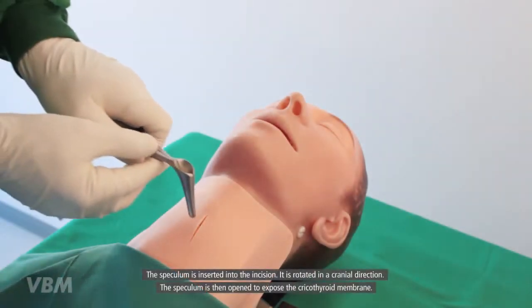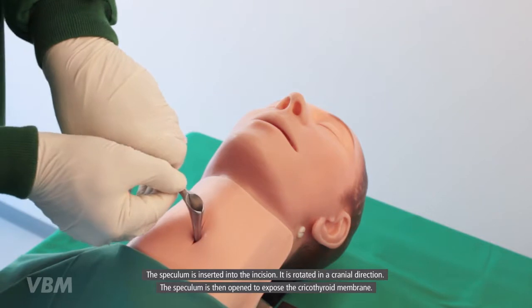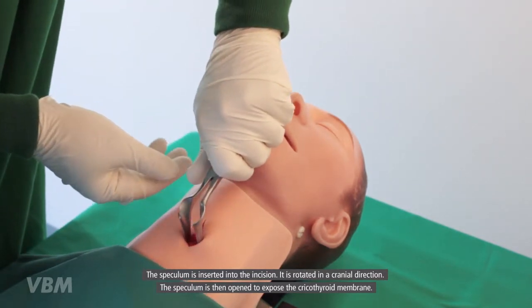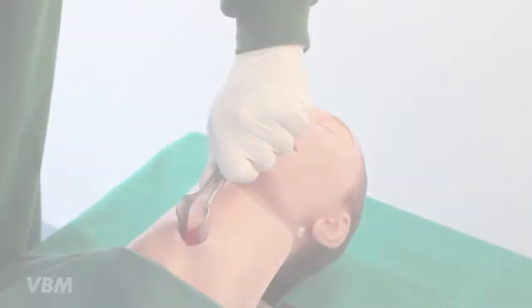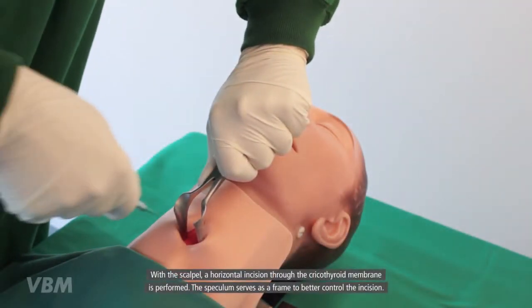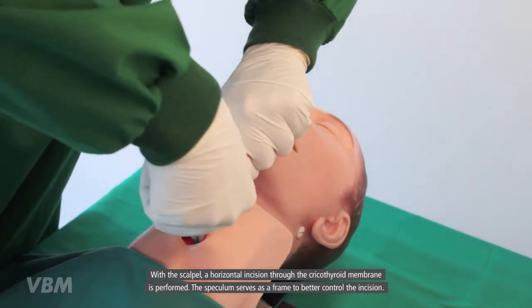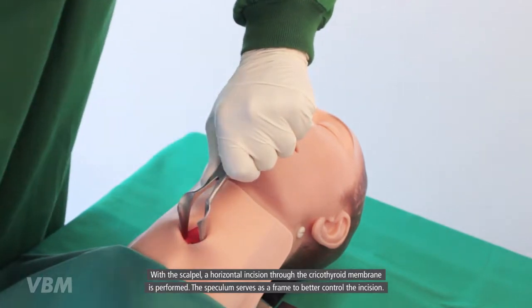The cricothyroid membrane is exposed using the scissors to perform a blunt dissection of the soft tissue. The speculum is inserted into the incision. It is rotated in a cranial direction. The speculum is then opened to expose the cricothyroid membrane. With the scalpel, a horizontal incision through the cricothyroid membrane is performed. The speculum serves as a frame to better control the incision.